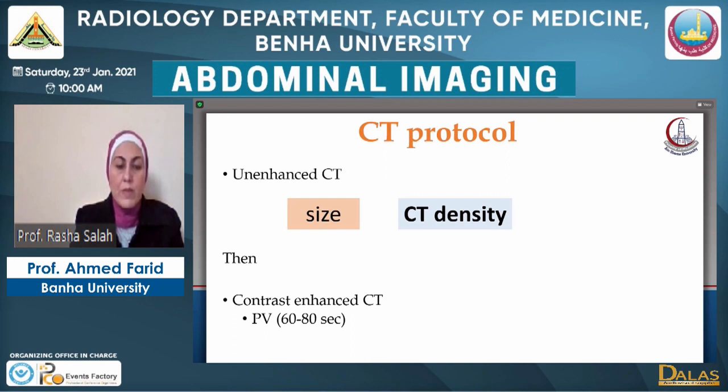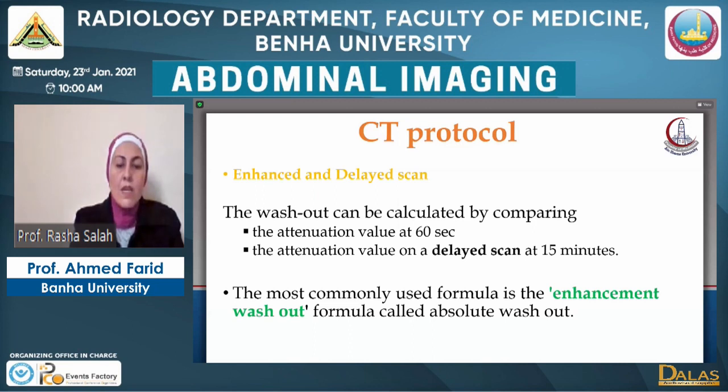First, we perform the portovenous phase, which is acquired 60 to 80 seconds after injection, and also delayed images from 10 to 15 minutes after the injection. And these are the crucial timings for performing the adrenal protocol for proper characterization of an adrenal mass.